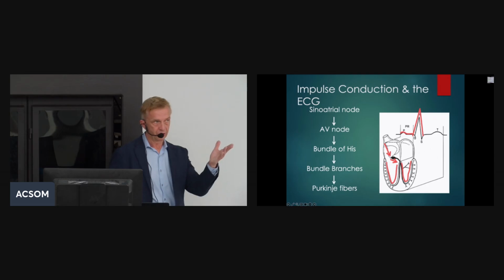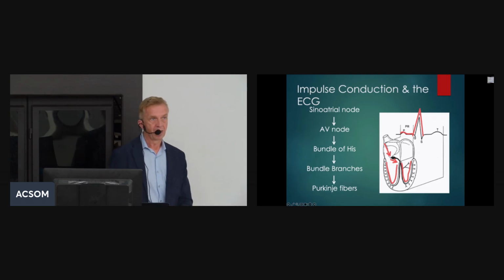We talked about the patient who had that myocardial infarction; these were pathological Q waves, which were taller and wider. This is a normal physiological Q wave. And then there is the R wave, caused by the depolarization in the ventricles, and the S wave, which is the second negative deflection in the QRS complex.